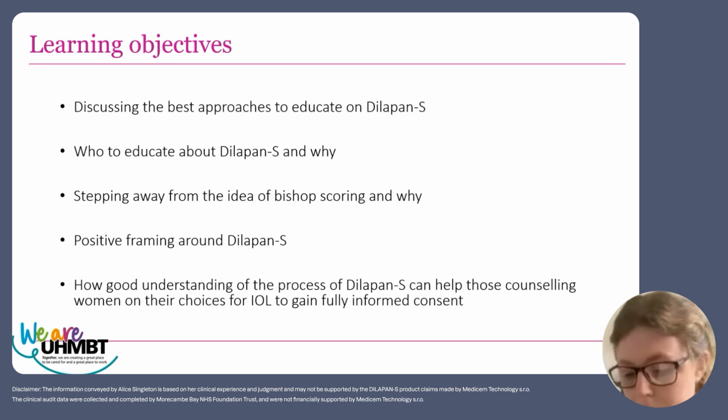The last thing I'm going to talk about is understanding by midwives and doctors. One of the things I've found in my training of staff is that if your midwives and doctors don't have a good understanding of what you're trying to do, where you're trying to place the Dilapan, and what the outcome is going to be, then I don't feel like they inform people as well. For example, if the midwives don't understand why the cervixes are funnelling, then they aren't going to realise what impact that will have on the women's induction of labour pathways. But equally, they'll carry on doing it because they won't realise what the anatomical impact of what they've been doing is.